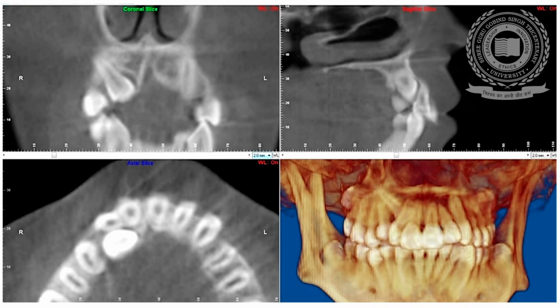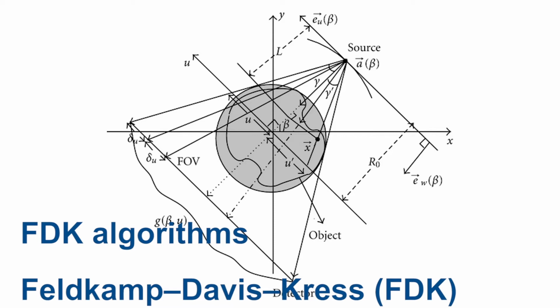Standard triplanar views include axial, sagittal and coronal slices as well as oblique slices through the reconstructed volume. In CBCT, 3D filter back projections are created using Feldkamp-Davis-Kress algorithms, which makes the reconstruction simple and fast. Typically, the voxels in CBCT are cubes as opposed to cuboids in CT.